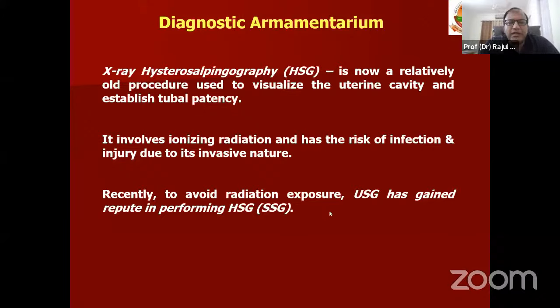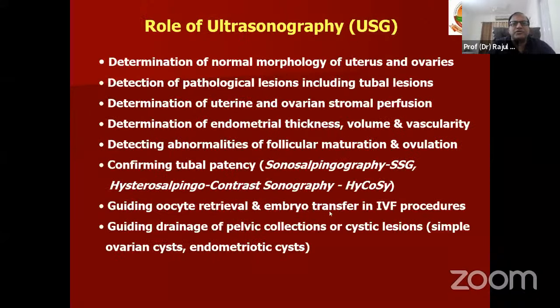So recently, we all know that to avoid these radiation exposures, ultrasound has gained repute, and it is being used in the form of sonosalpingography or hystero contrast sonography. So, what is the role of ultrasound? What type of information will it provide us?